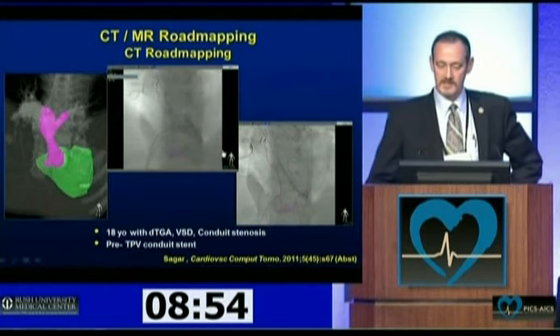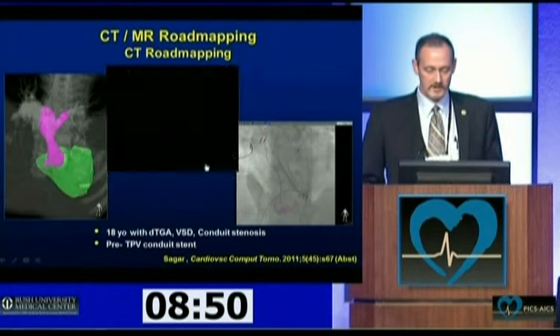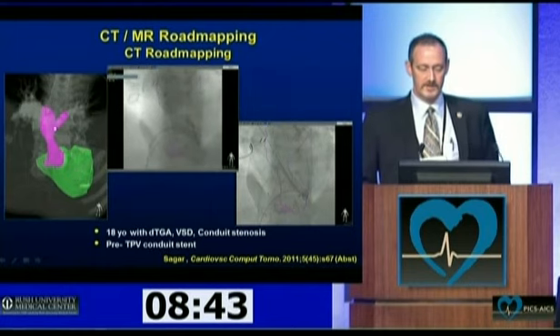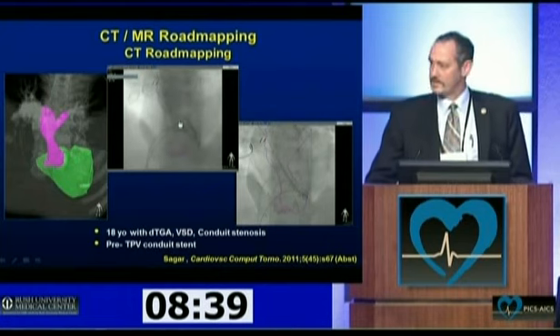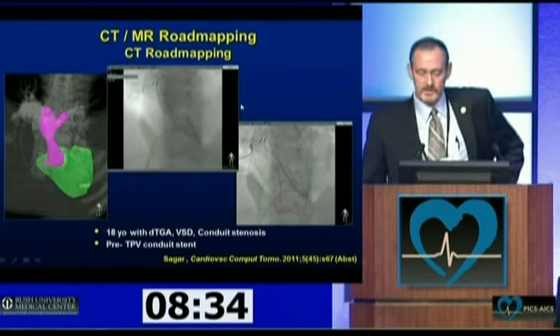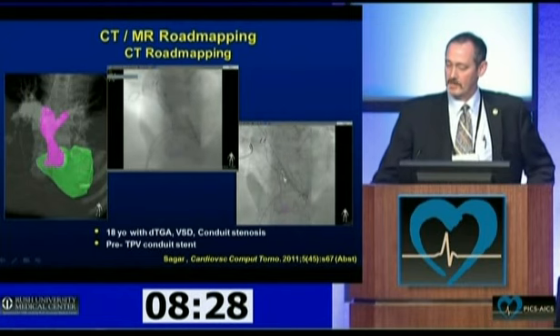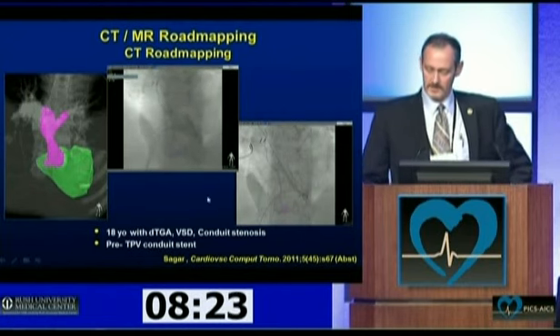So here's that same example, and this was used for stent placement in this conduit prior to transcatheter pulmonary valve. Again, you see the surface rendering, the three-dimensional images, on the far left, the right ventricle to pulmonary artery conduit, and the outline form, documenting here a hand contrast injection showing the registration and anatomy, which seems to be pretty dead on for this patient's anatomy. Then we use that for positioning our stents and stent delivery, as you can see in the frame on the far right.